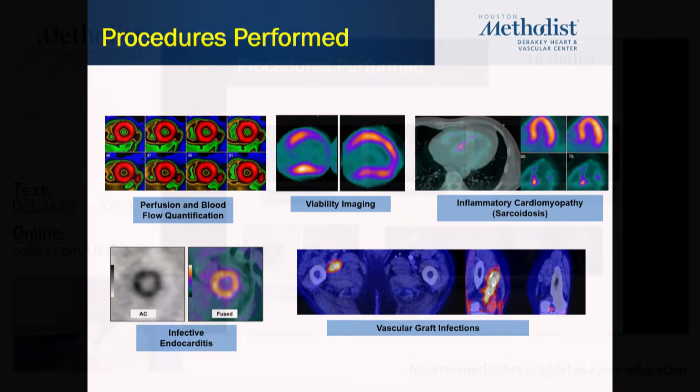Now, in specific sarcoma, malignant versus benign cardiac, I don't know of a specific study looking at it, but in general, to differentiate benign versus malignant, PET is the way to go for these patients, whether it's in the lung, in the brain, and many other organs. This is how oncologists use PET to differentiate malignant from benign.